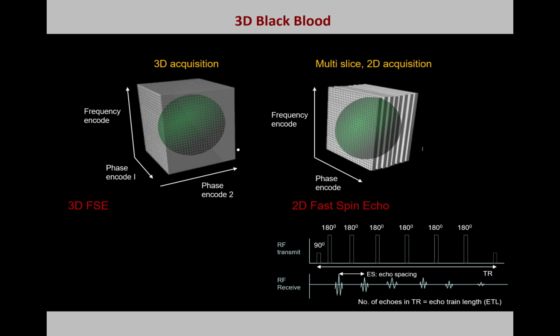So can we translate fast spin echo to 3D scanning? Yes, but to make it practical for substantial volumes, fast spin echo has to be adapted or optimized for 3D. We are going to need long echo train lengths, and one problem we can see from the 2D case is how the echoes fade away with time, with long echo train lengths and echo spacing. This is just a result of normal T2 decay. To get over this problem in the 3D case, we apply some tricks.